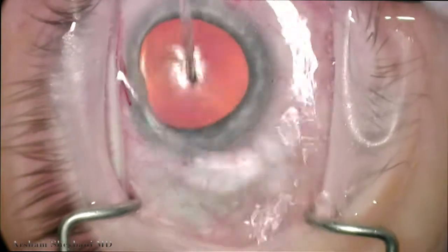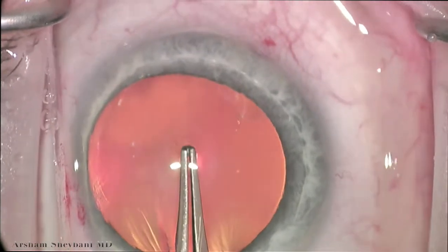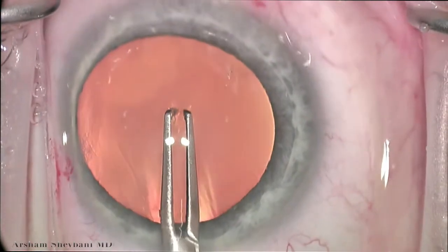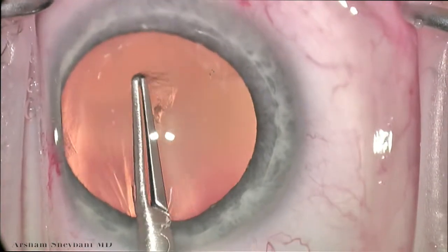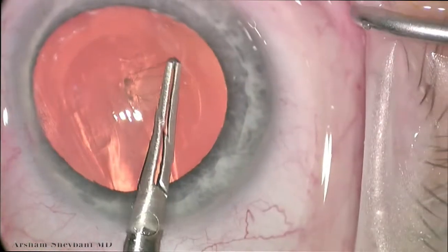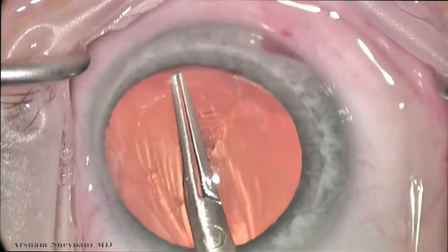We then rotate the patient's eye back to ortho. This is again a Katena instrument — it's the Inamira forceps. They're self-puncturing capsulorhexis forceps. I really like them for a couple of reasons: there's less instrumentation to come in and out of the eye, and they behave very, very well inside the eye.